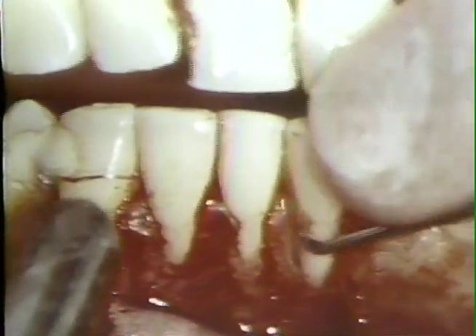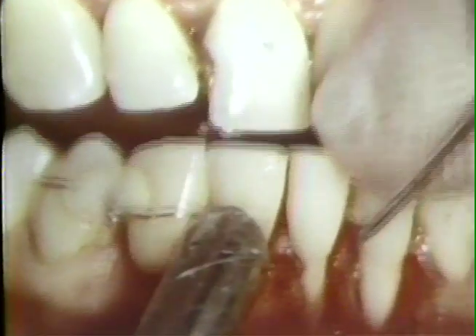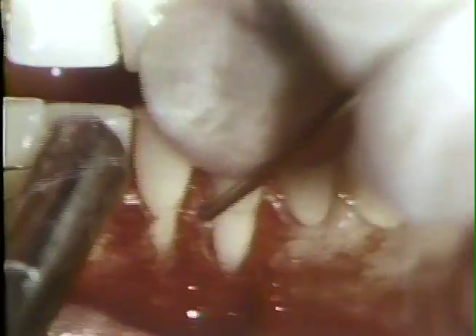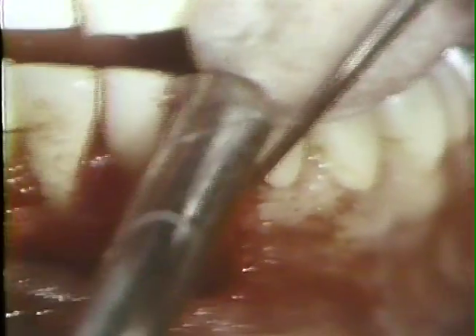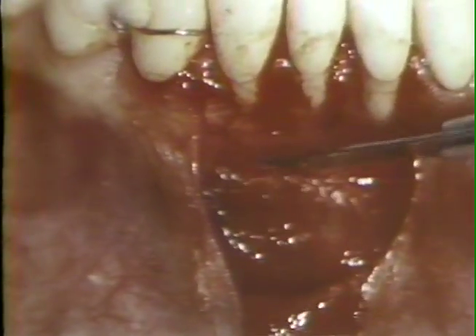The planing of the tooth surface adjacent to the cleft permits some exposure of the periodontal ligament fibers that extend from the tooth to the interdental bone. It's felt that the proliferation of tissue from this site enhances the repair of the laterally positioned flap. The flap is reflected and brought into position at the recipient site.